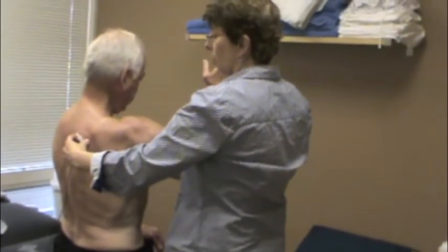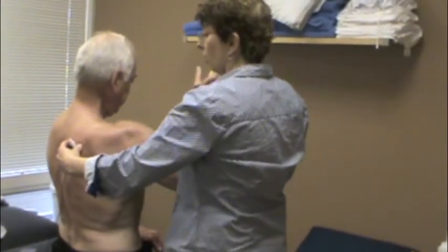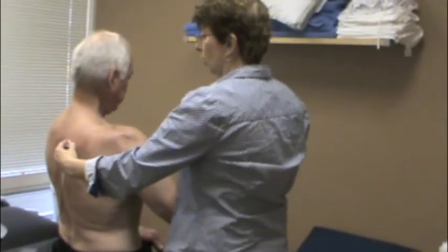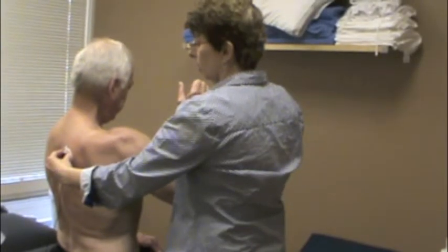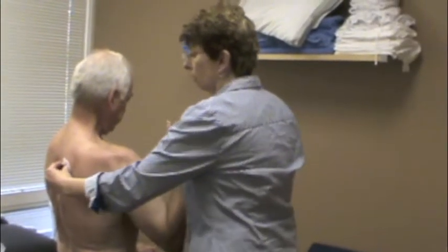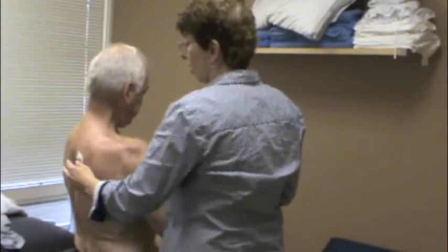Good, and let it go down and up. That's better, because I don't want that to come on — I want these to come on. Hear that? Buzz, buzz, buzz, buzz. Pull back — there you go, yeah, that's it. Good. And one more — pull back there and up.